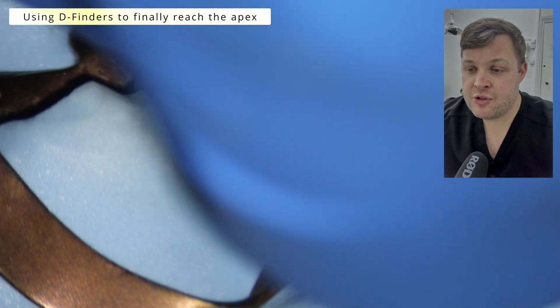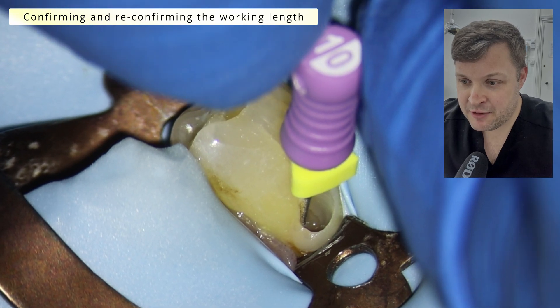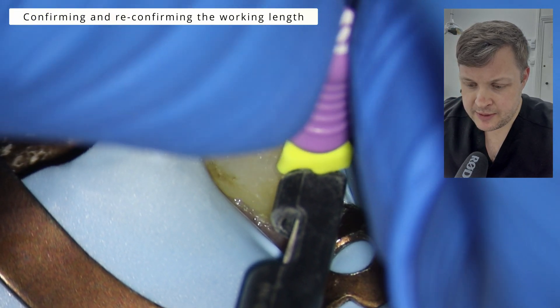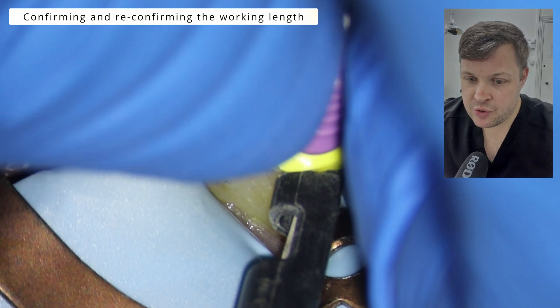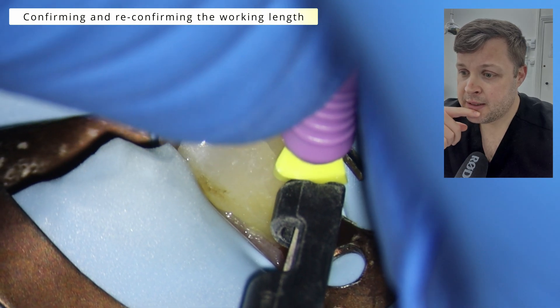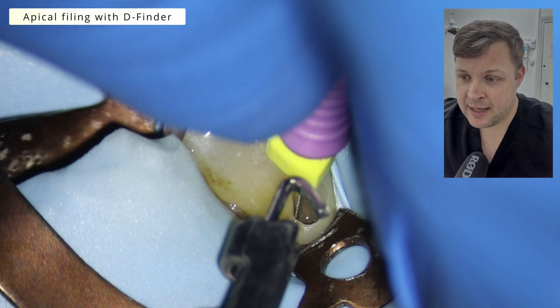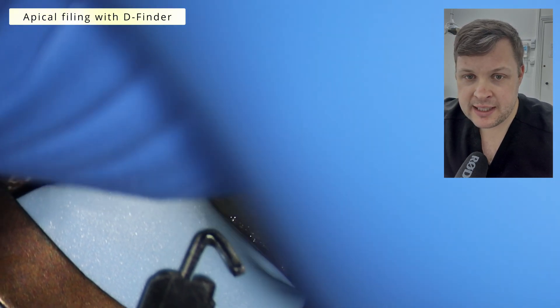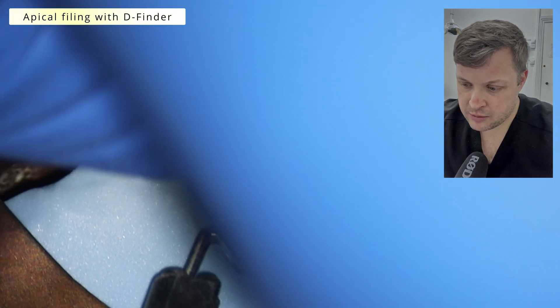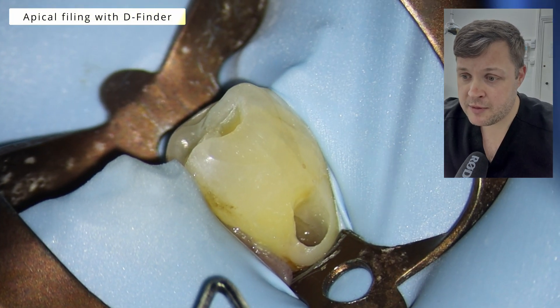As you can see, the D-finder has just dropped in and we've got a nice zero reading on the apex locator. At this point, when you get to the apex, you don't want to pull the hand file out straight away — you want to ensure you've shaped whatever you've bypassed enough to get a higher diameter file in past where it was getting stuck. I'm very gently moving the hand file up and down to shape out that ledge, anatomical anomaly, or fin/fissure the file was getting stuck on before — some gentle in and out with lots and lots of irrigation.